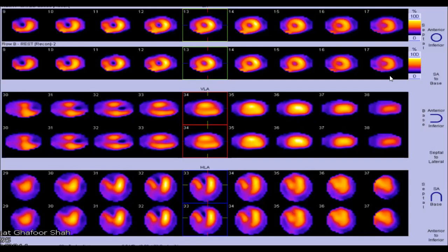Hello, Dr., it's Danish. There is a moderate size partial reversible perfusion defect involving the apical anterior segment, and also another partial perfusion defect at the apex.